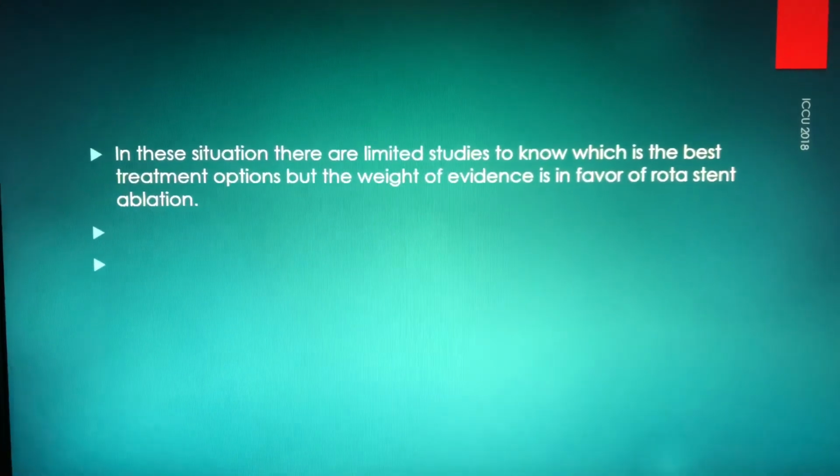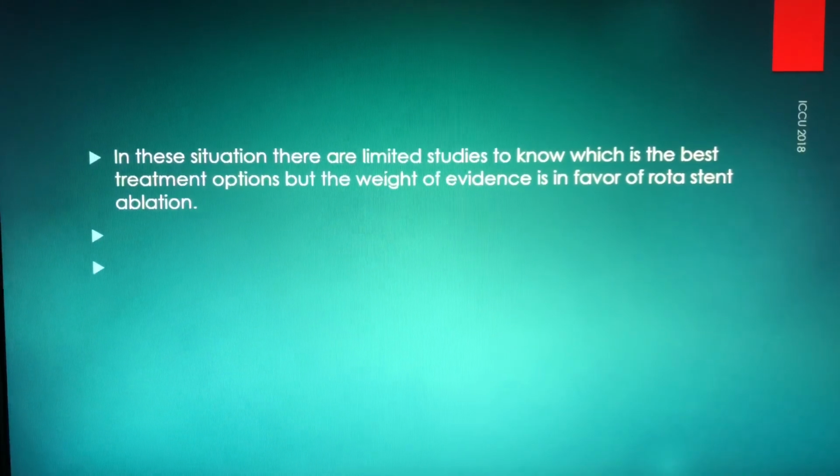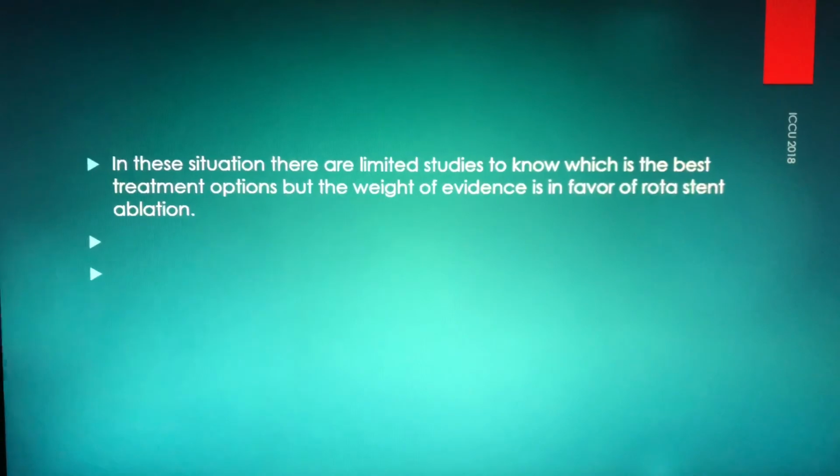So in this situation, there are limited studies to know which is the best treatment option, but the weight of evidence is in favor of rota stent ablation if shockwave therapy and laser are not available.